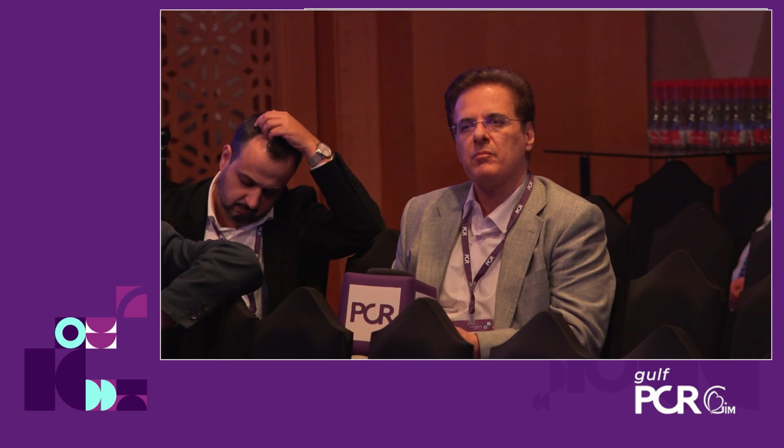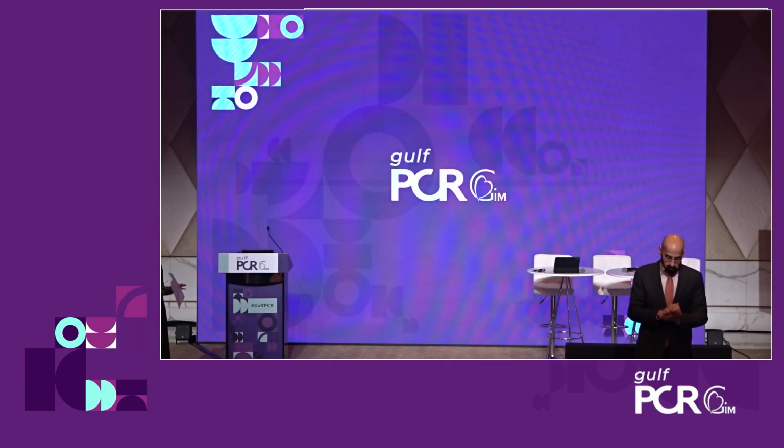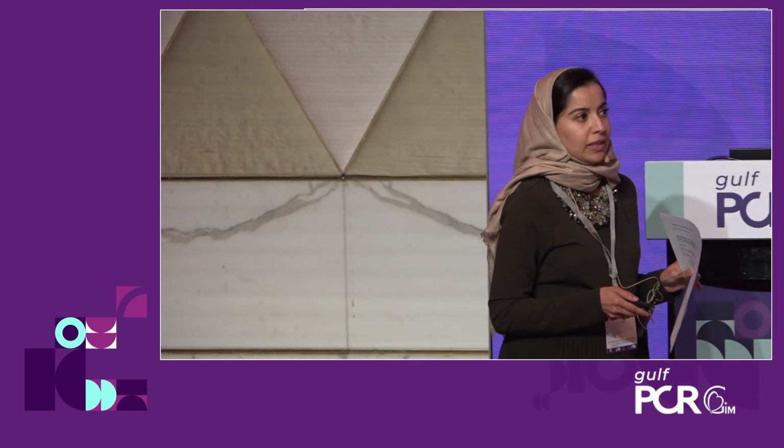And do you suggest pacing during the last step of the implantation in this patient or not? We typically do. I know some centers sometimes do, it depends. But definitely the first step you don't. Second step, if you're worried about any movement, I think you can do it. It's not mandated at 180 as we typically do with the balloon expandable.